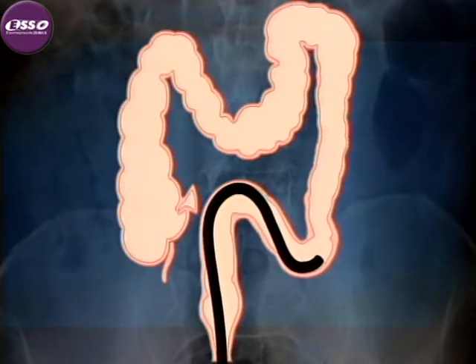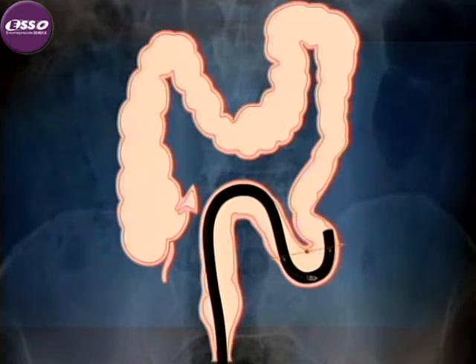With the scope passing through a turn in the maximum 180-degree up direction, the lens is against the wall. By deflecting maximum left in addition to maximum up, the tip now turns into the lumen, completing passage of the turn.